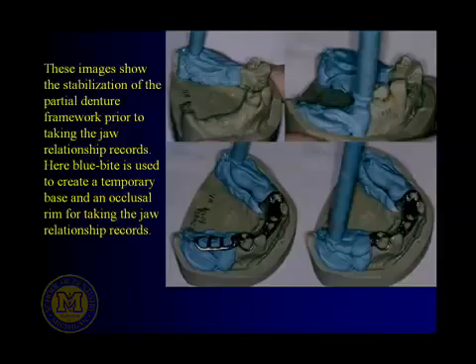What one does is, you'll notice here, takes the framework off the model. And you grease the edentulous ridges here with some Vaseline. Or in the back, you'll see that Triad model release agent, which is essentially white Vaseline, but because they package it and call it Triad model release agent, they move the decimal point one place to the right. The second anything becomes dental, it's just plain old Vaseline. But instead of 79 cents a tube, it's $7.90 a tube now, because it's a dental product.